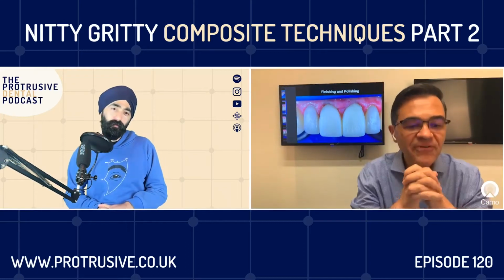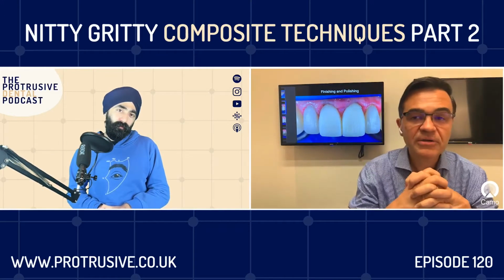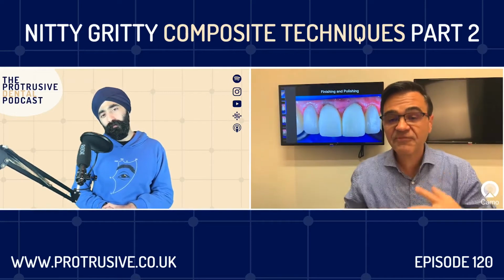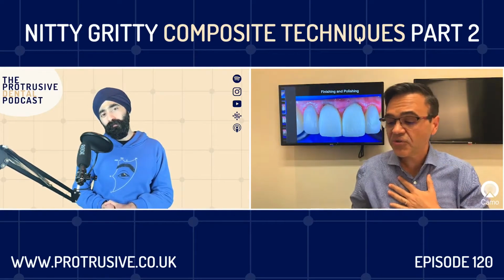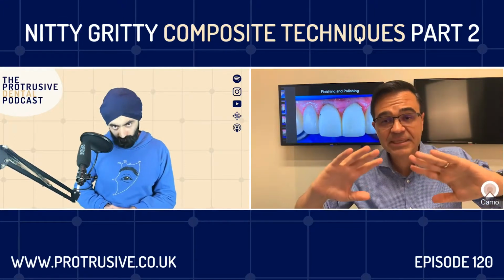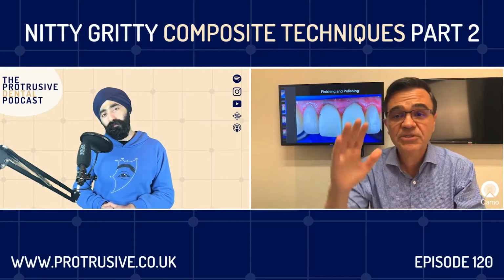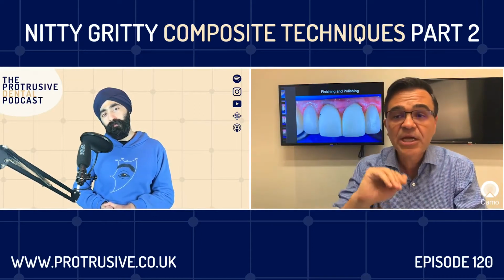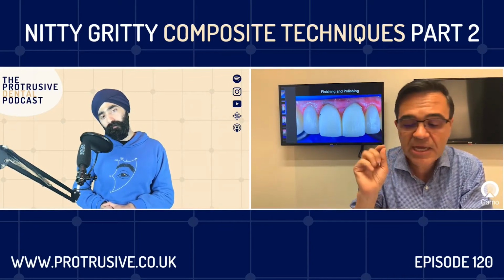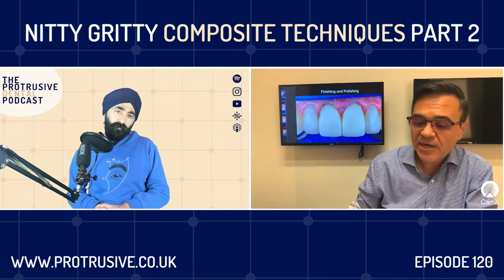So the number 5 P of composite veneers is polishing. So you have 2 steps. The first step is finishing, and you're gonna finish your veneers first. I use a brush at the end with my microfill composite. I place it with my IPC, and then I use a brush. Why the brush? Because the brush will give me a very, very close surface to what I want to achieve, and you can see it here on the screen. And that brush makes the tooth smooth.